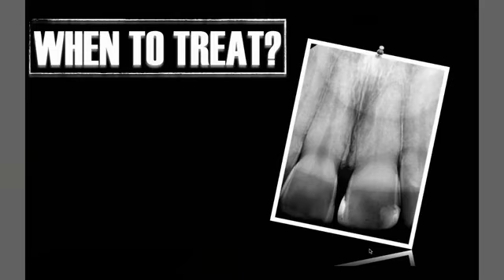And have you never used alcohol just to dry the pulpal floor? It's very useful to use alcohol, but actually I don't need it because I can dry it with air enough, and it's more than enough to dry it with air completely, and you will see the difference in the color.